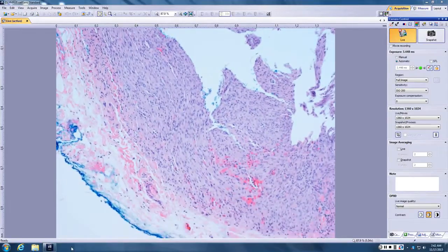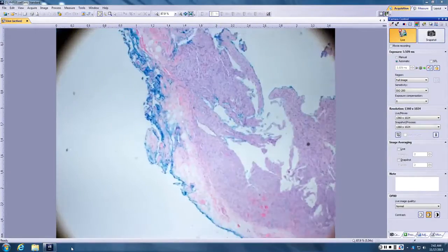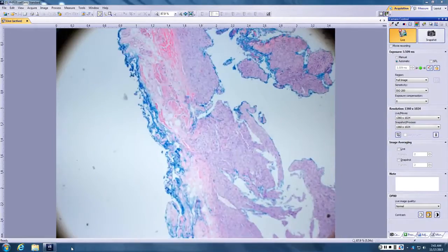So we just finished looking at a nodule in the dermis of bland fibroblasts with extravasation of red cells. And it happened to sit right adjacent to striated muscle, which was a clue that it was fascial in location. So nodular fasciitis: nodule, bland fibroblasts, red cell extravasation.